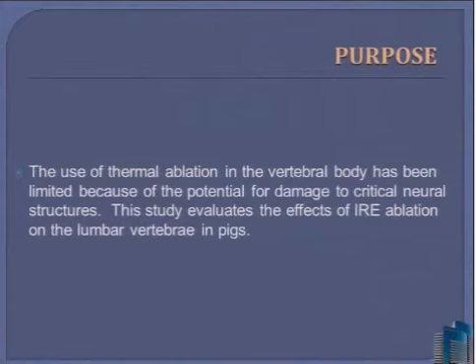The use of thermal ablation in the vertebral body has been limited because of the potential damage to the critical neural structures. The aim of our study was to evaluate the effects of IRE ablation on the lumbar vertebra in pigs.